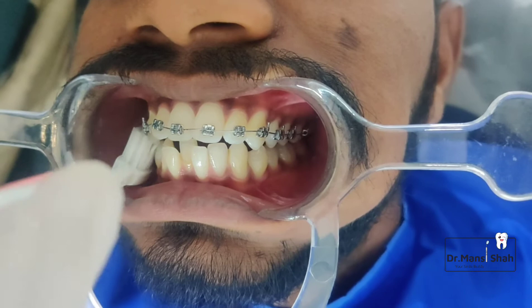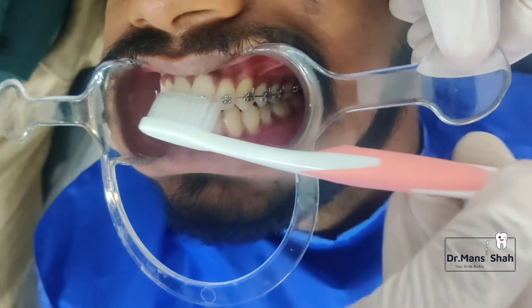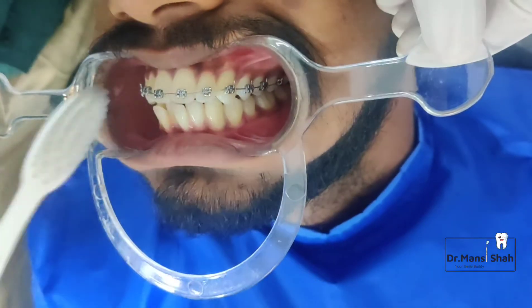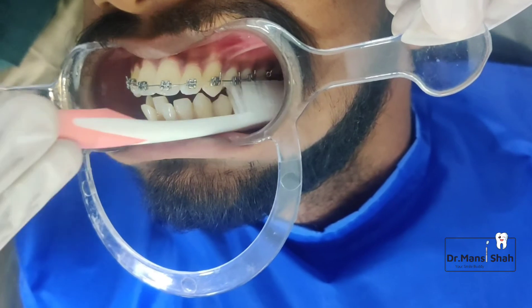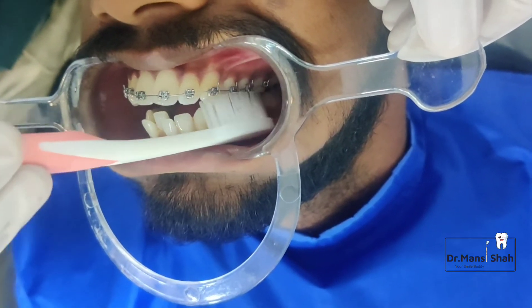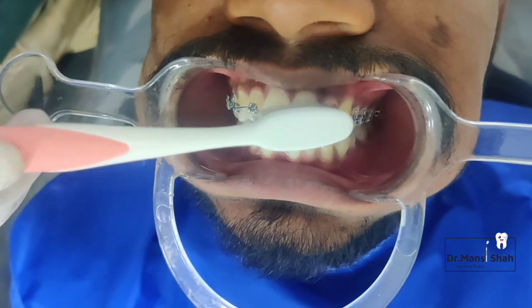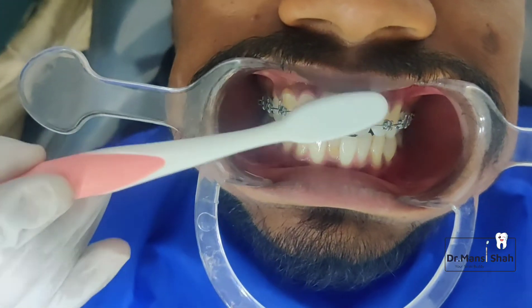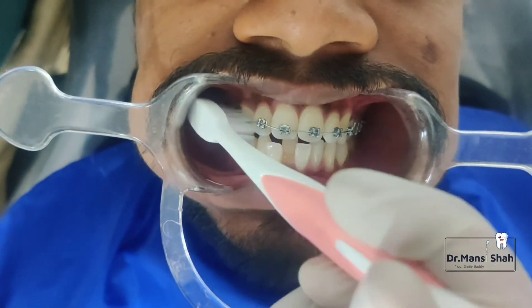Start from the top of your braces with enough pressure to remove the plaque from the teeth and the wires. Next, go underneath the braces — the pressure should be enough that the plaque from the wire and the teeth is removed. Do not forget the back teeth; do not only brush your front teeth. Next, come to the front of the braces directly.